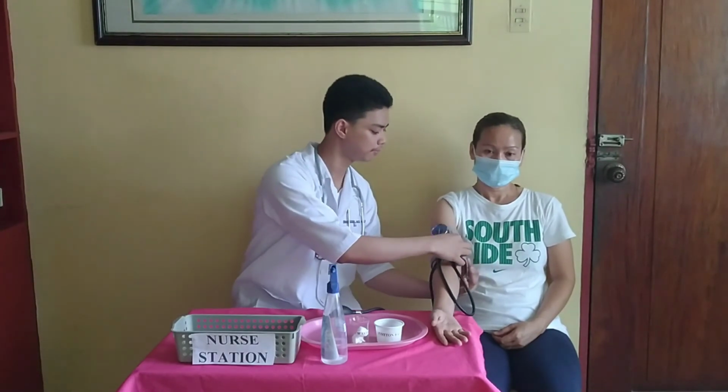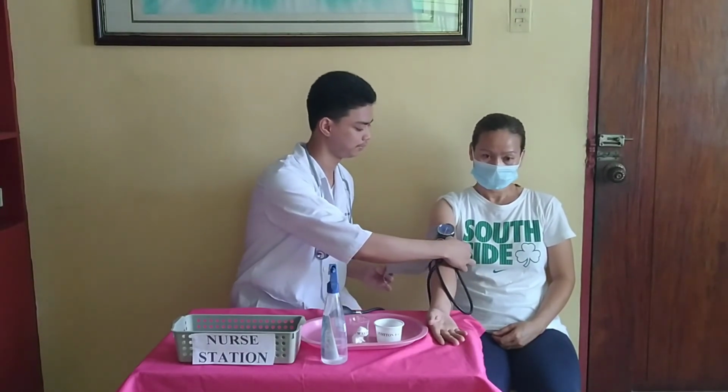Then, remove the cuff. Then, wipe the cuff with approved disinfectant.